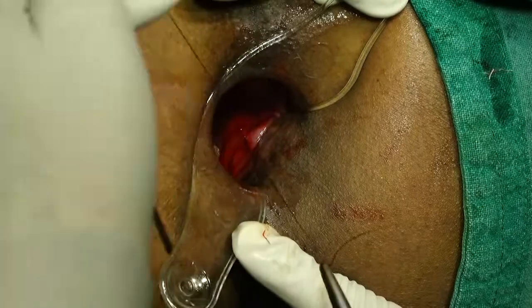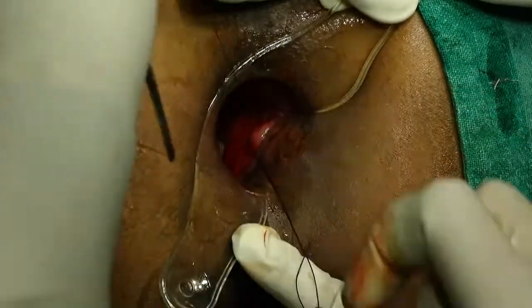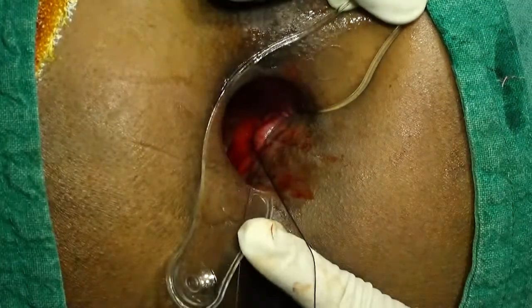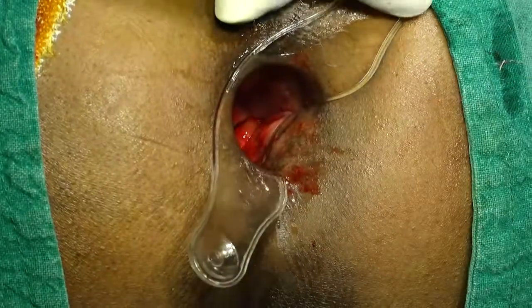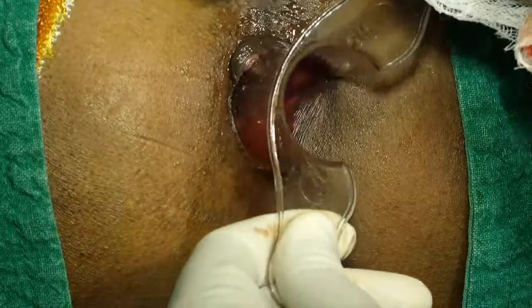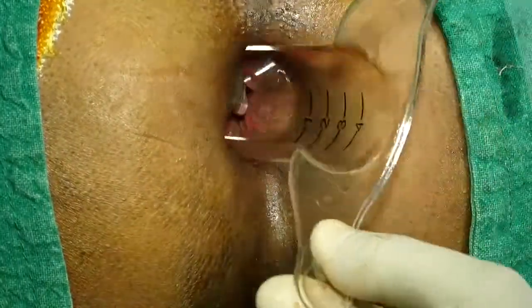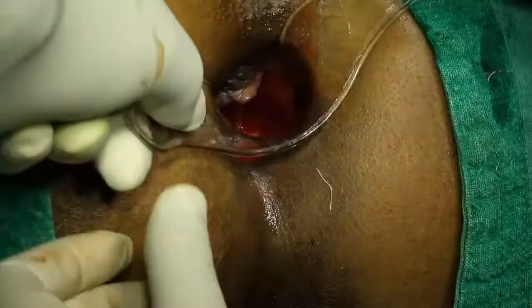What is the principle of laser? Laser is doing photocoagulation and photoevaporation. It breaks the hydrogen bond and oxygen bond of the water and it evaporates. That is photoevaporation. And at the same time it generates heat to cause photocoagulation. So laser itself is a tool to achieve de-arterialization. So you can achieve de-arterialization by laser, by ligation, by sclerosing, or by other methods.